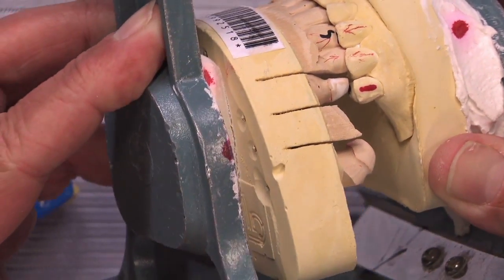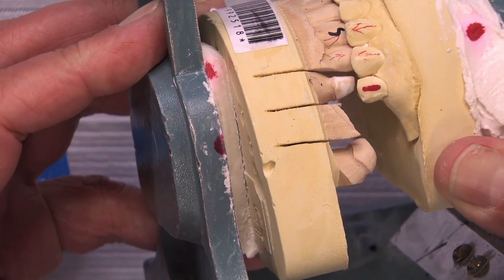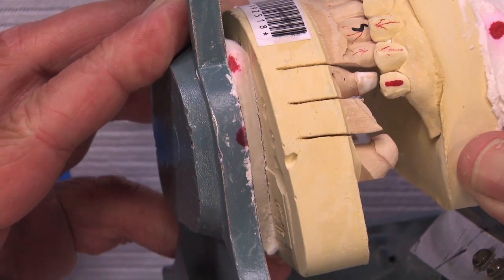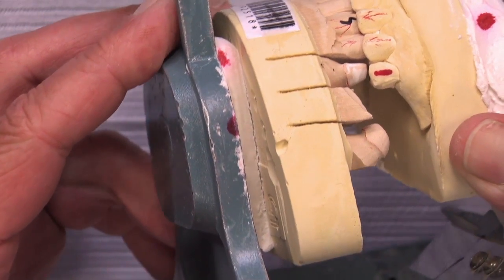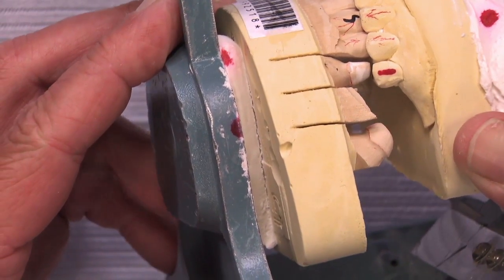So when we look at it now, you can kind of see that black spot that's there. And again, we have our minimum 0.6 of a millimeter reduction. That might be a little more. That could be 0.8, maybe up to a millimeter here.